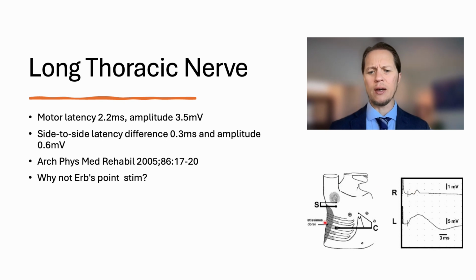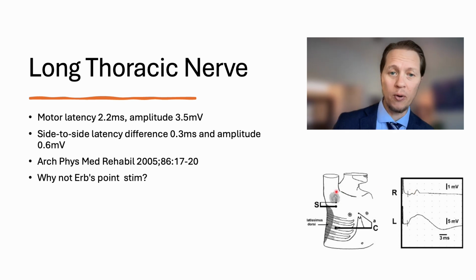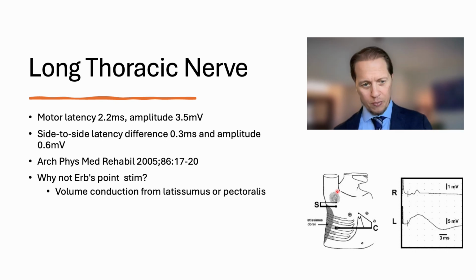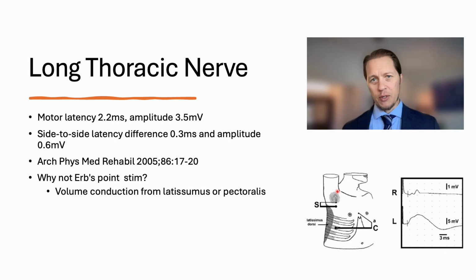Some people say, now, if I stimulate here, why can't we go proximally and stimulate at Erb's point? And yes, you can, but what's going to happen, right? Pause, think about it, figure out what the problem would be with this. All right, I hope you thought about it. Volume conduction, right? The lats or pecs, when you stimulate up at Erb's point, you're going to get everything else in the 5, 6, 7 area there, and you're going to get a messy waveform if you do it proximally, so it's usually not done.